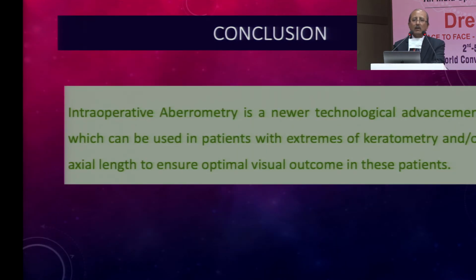So in conclusion, intraoperative aberrometry is a newer technological advancement which can be used in patients with extreme keratometry or axial length to ensure optimal visual outcome in these patients. Thank you very much.